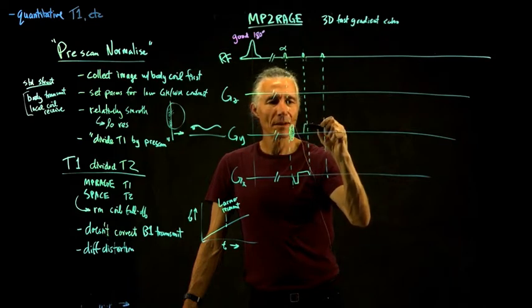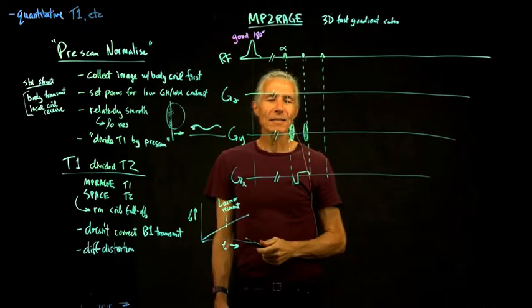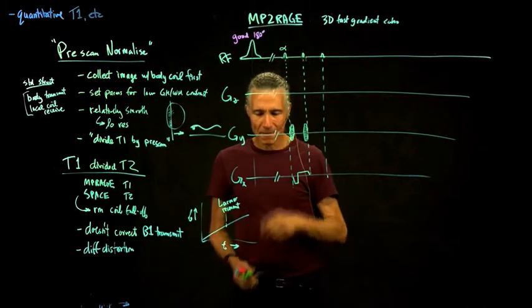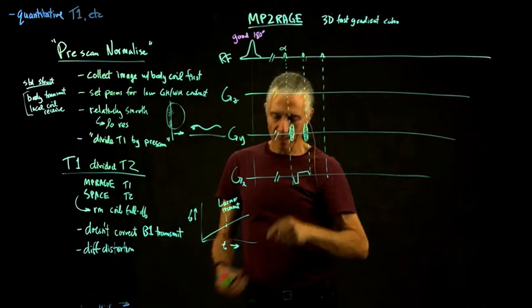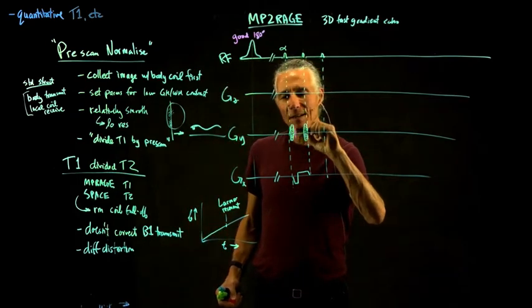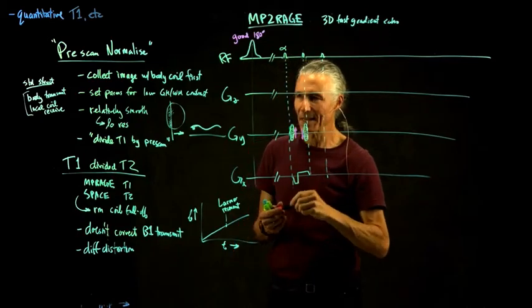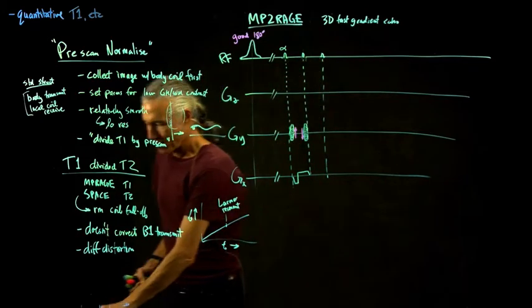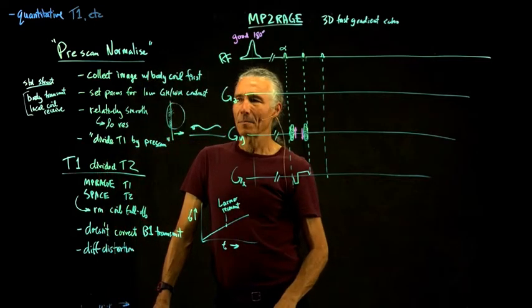And it turns out when I read this, I just read this paper last year. It's a paper from 2010, but I finally just read it. They actually do something that's a little bit more like a fast spin echo. They do phase encoding that way, and then after they're done, they kind of fix it. So it's almost like a steady state type gradient echo.